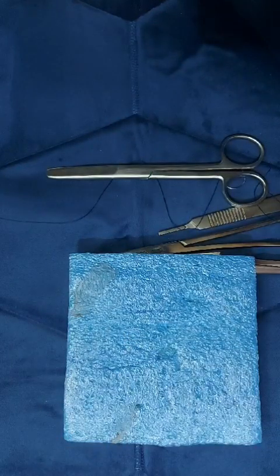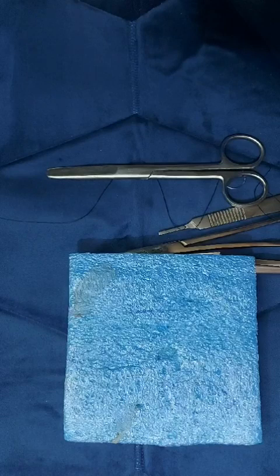Sadia and I am going to demonstrate step by step the suture techniques and the types of sutures we come across in dermatology. There are multiple types of sutures like simple interrupted sutures, running sutures, mattress sutures including vertical mattress sutures and horizontal mattress sutures, and also the buried sutures.